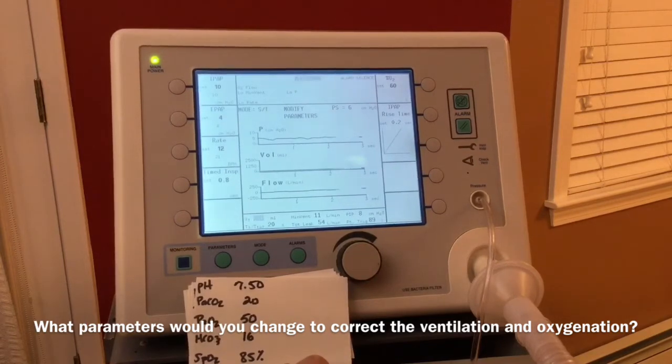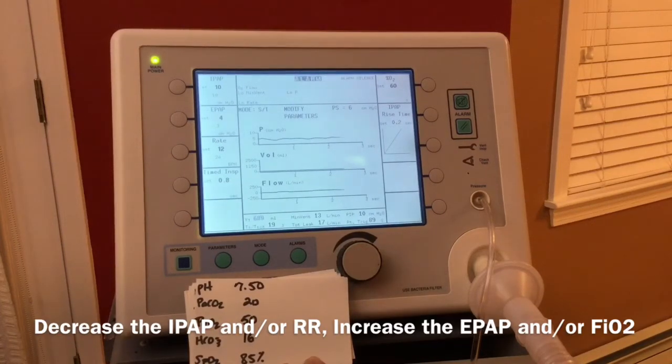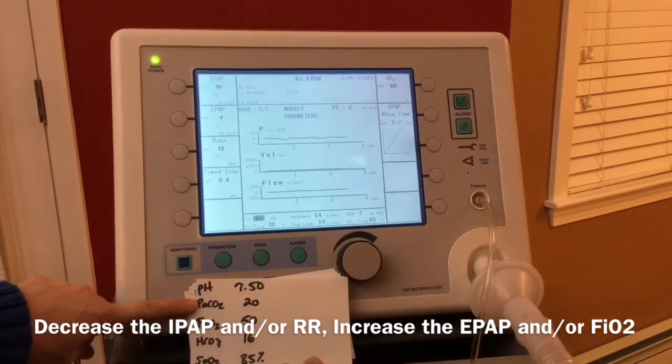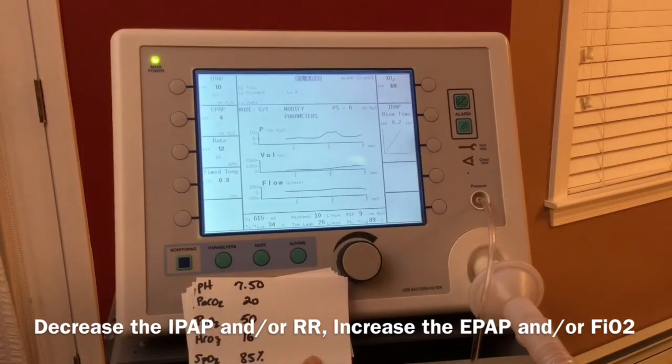Pause the video. If you stated you would decrease the IPAP or decrease the respiratory rate to increase the PaCO2 and correct the respiratory alkalosis, you were correct. If you said, increase the FiO2 to correct the hypoxemia, you were correct.